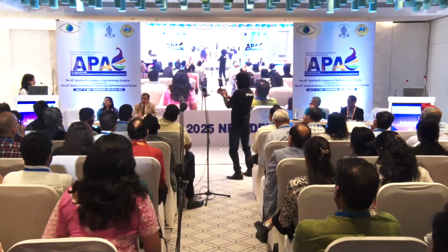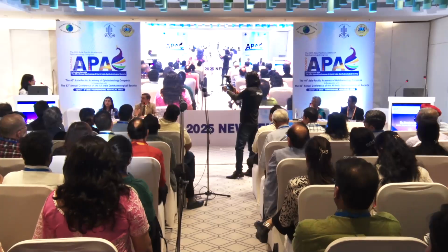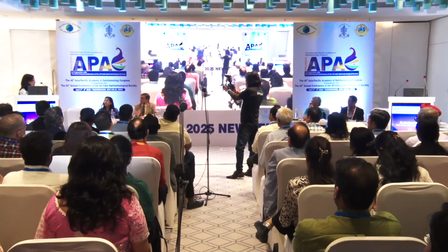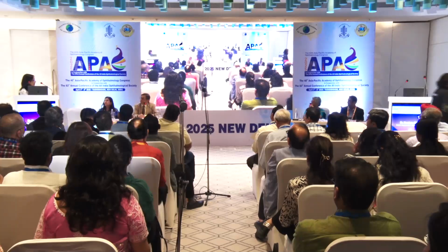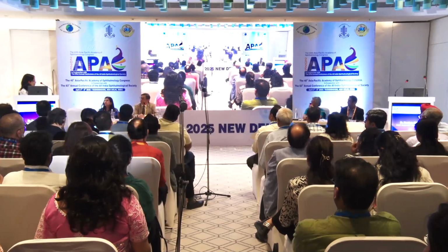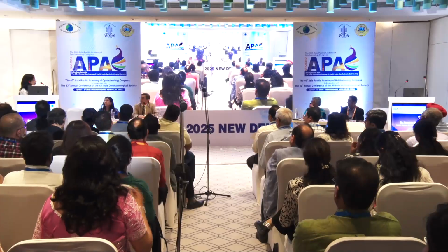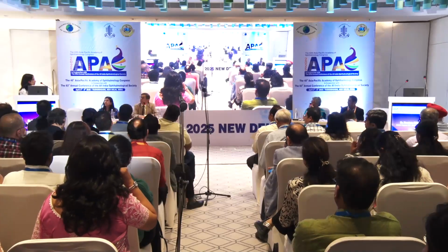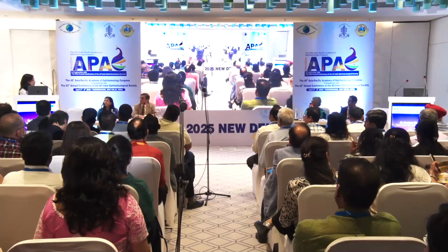Are we using the intraoperative OCT? Even without an intraoperative OCT, you could do a descemetopexy, isn't it? Chances of entering a wrong plane are there, and sometimes we have to retake the patient to the OT. So those chances are minimized. Though these days, it's more of an academic tool. We learn a lot by doing intraoperative OCT. It's not necessary, but it's an additional tool.